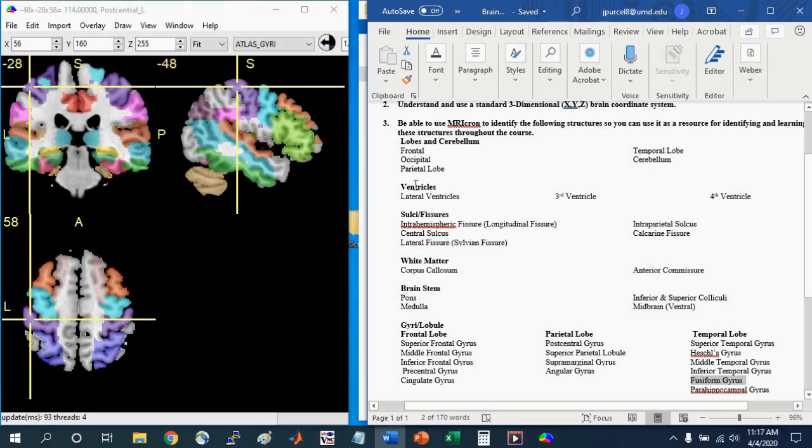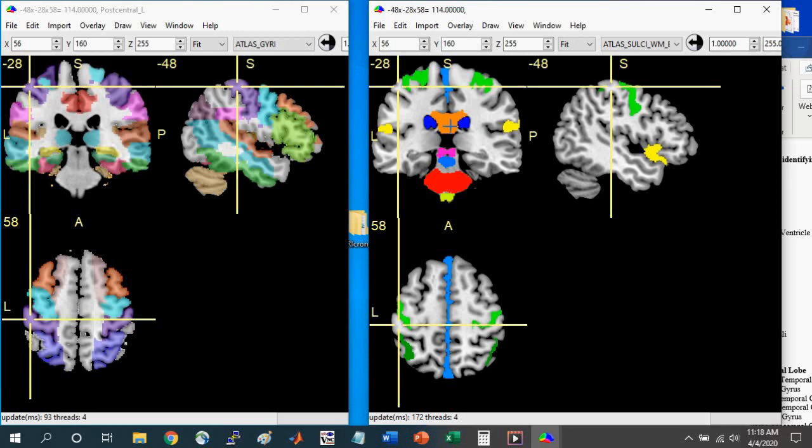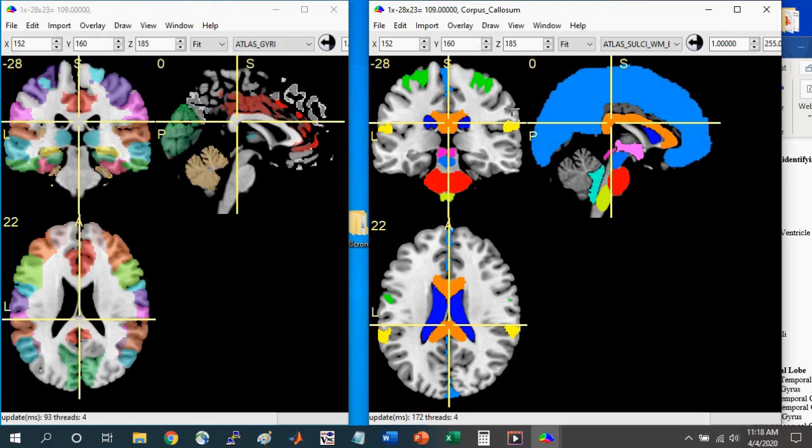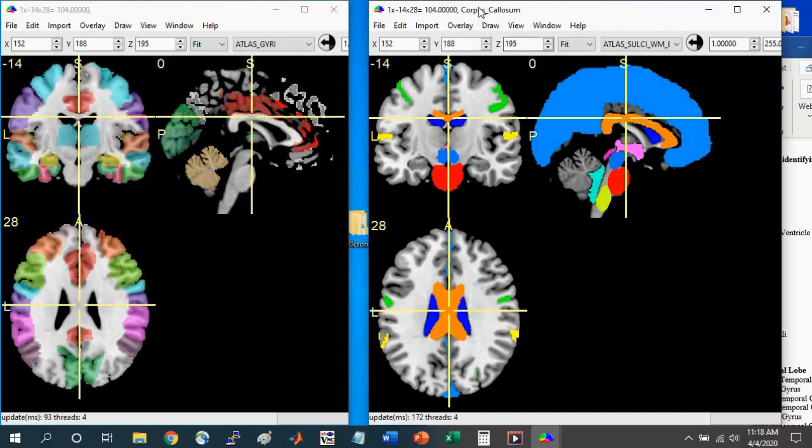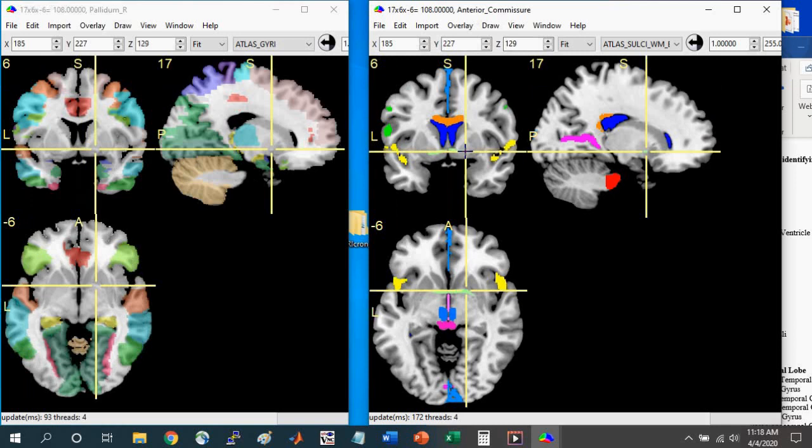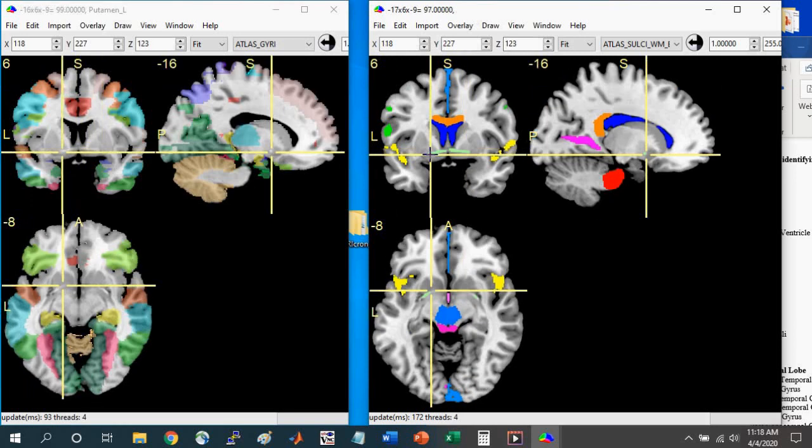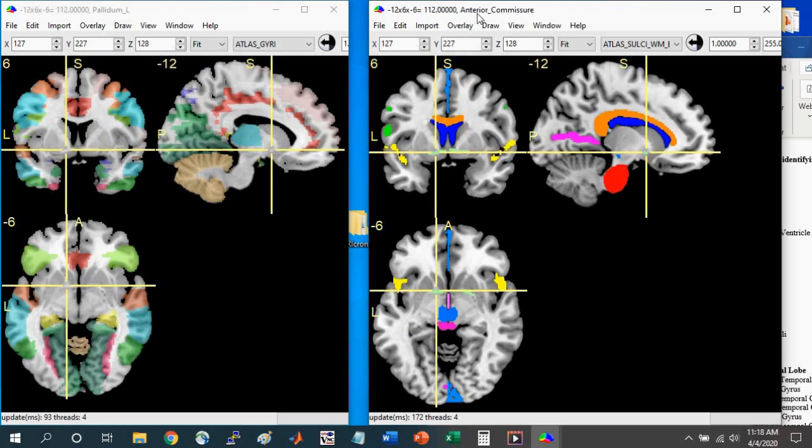Going back to our list of structures, you can identify all of these structures that are listed in the three atlases that I went over. For further example, we can see the white matter structures here, the corpus callosum and the anterior commissure. If we go back to the sulci white matter brainstem atlas, we can select different colors and get the brain regions associated with it. Here in orange is the corpus callosum. Down here in green, this line that spans the hemispheres is the anterior commissure. One way to learn these structures is to select a given color, identify the brain region, study it, and then try to quiz yourself later by covering up this name here and trying to identify the brain structures just from memory.